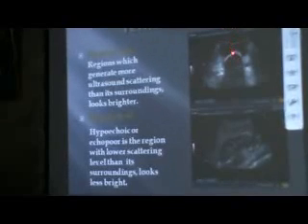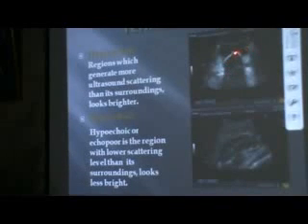There is no reflection from the fluid; all the waves pass through and through, whereas from the stone surface there is either absorption or reflection. So the stone surface will be more echogenic as compared to the fluid in the bladder. This will label the stone as a hyperechoic substance, and there will be a deficiency of ultrasound behind the stone or bone, because all the ultrasound waves either get reflected back or are absorbed in the stone.